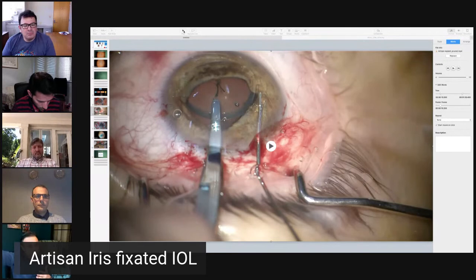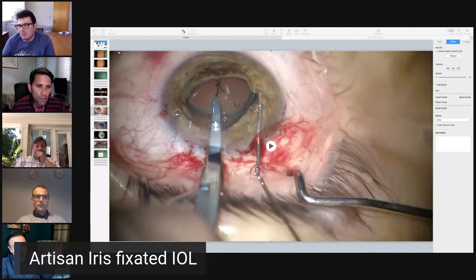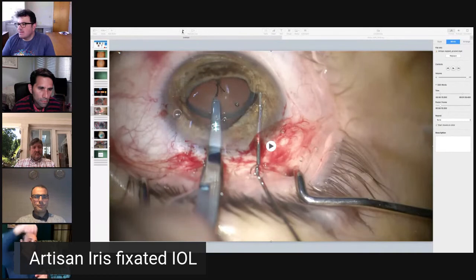So if it falls, we remove lenses from the posterior chamber. In more than 400 cases, I've only had my second case that dislocated, and it was one of the haptics, one of the clips. That was because the day after, the guy opened a cupboard and banged his eye and dislocated the lens traumatically. So they're fairly stable.